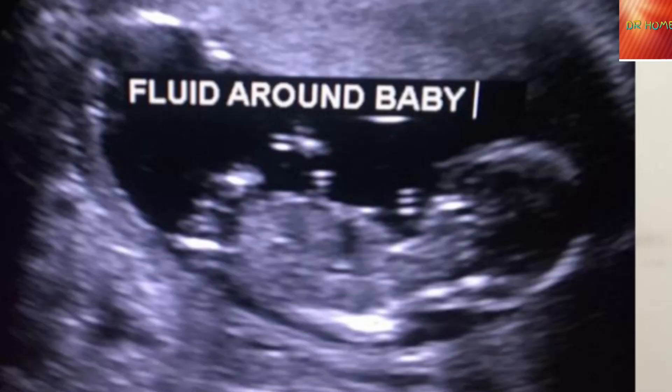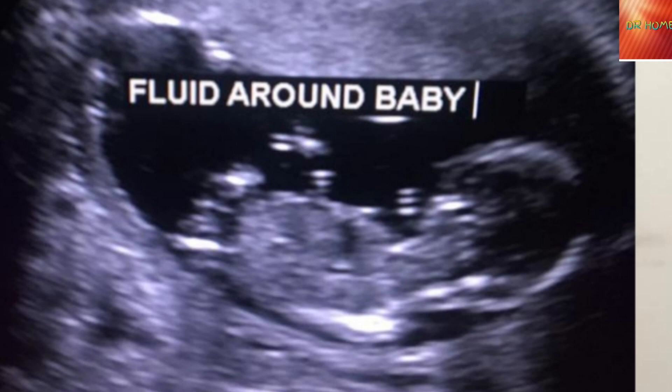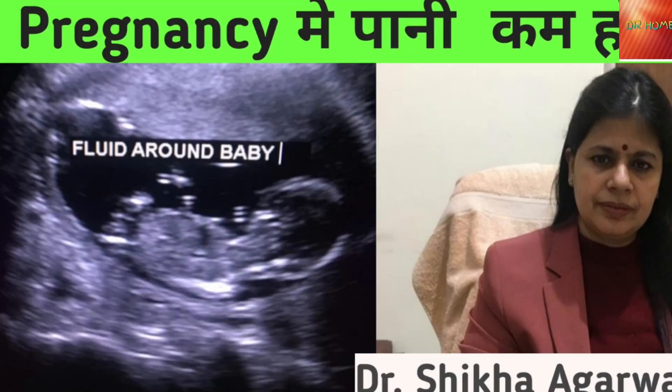In the growth scan, we also check the four levels of water around the child, which is called amniotic fluid. The child survives in this fluid — the child drinks this water and passes it out as urine, which is how amniotic fluid levels are maintained. If the four quadrant fluid level is low, it is called oligohydramnios, and maintaining adequate amniotic fluid is very important for the child.